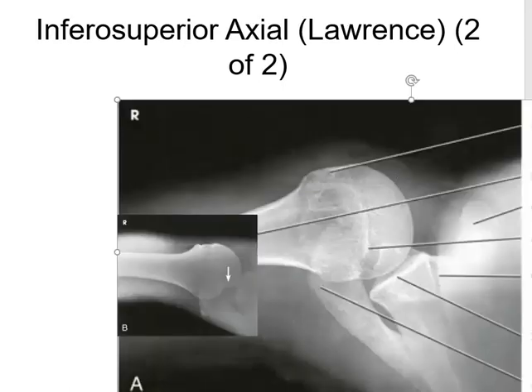So really the coracoid process should be a little bit closer here, but it should look like it pretty much rises straight out of the glenoid cavity. So you've got the glenoid cavity here, and it should come up, maybe a little bit of a transition, and then the rise of the coracoid process.